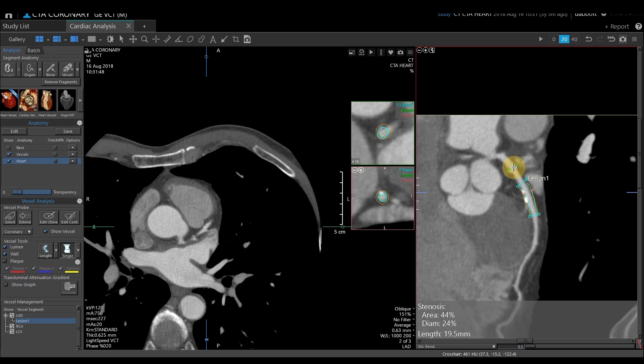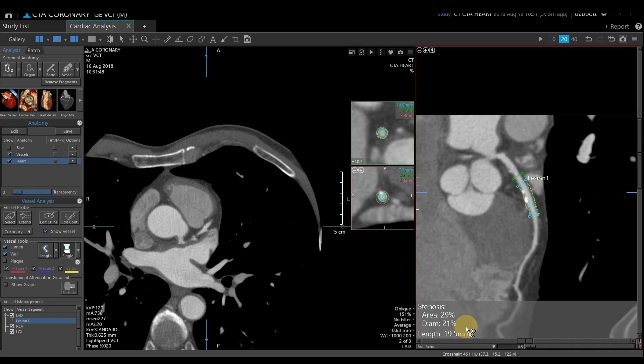If you don't agree with the reference vessel placement or would like to move it, you can left-click and drag it to where you consider normal vessel. Once you get that in place, directly below it will give you the quantification between your reference vessel and your narrowest vessel.